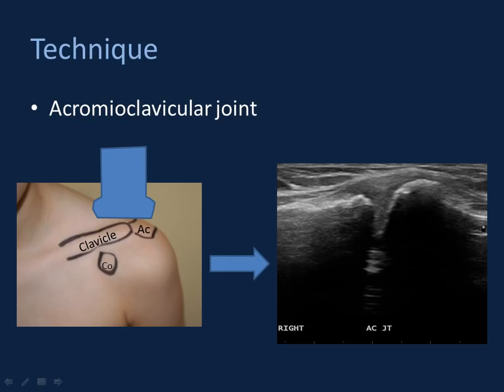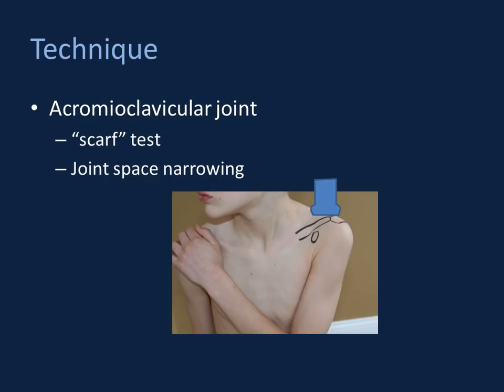Throughout the course, I'll show representative images, but recognize that real-time you're sweeping your probe posterior and anterior to image the entirety of the AC joint. One of the powers of ultrasound is our ability to image dynamically. You can perform a cross-shoulder adduction test — referred to as the SCARF test — having the patient grab their contralateral shoulder while watching. You're looking for movement at the acromioclavicular joint: asymmetric widening, narrowing, or offset, which may imply instability.